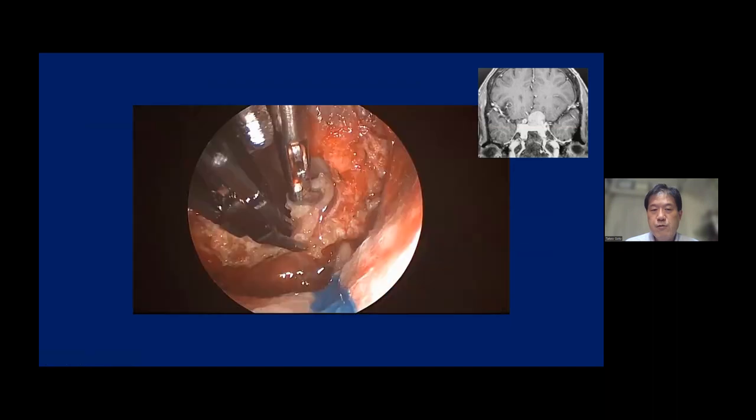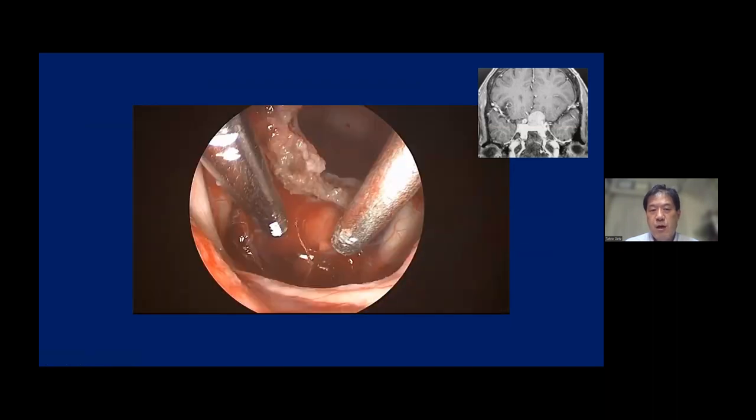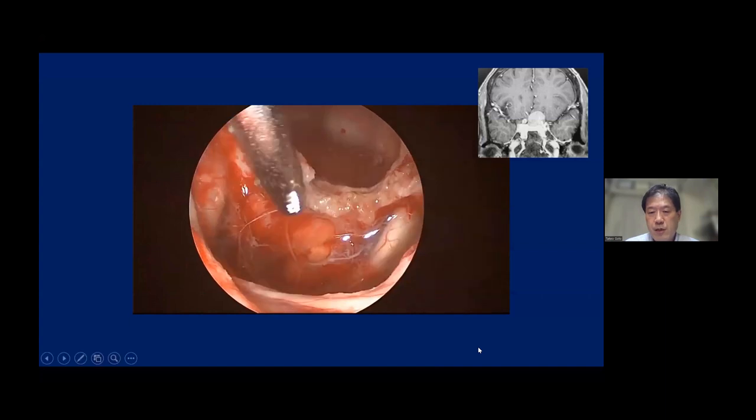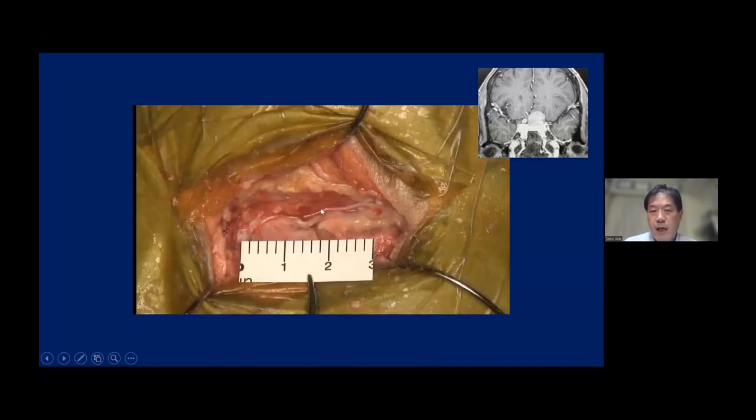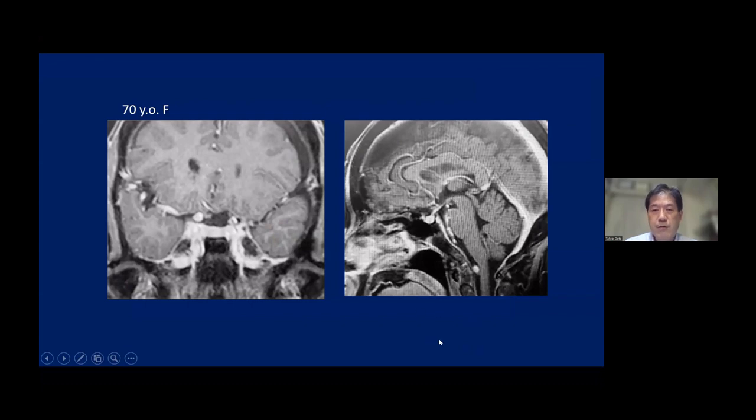The surgical view is very similar to that of the interhemispheric approach. So we totally resected the whole tumor like this. This is a post-op MRI. Tumor was nicely resected.